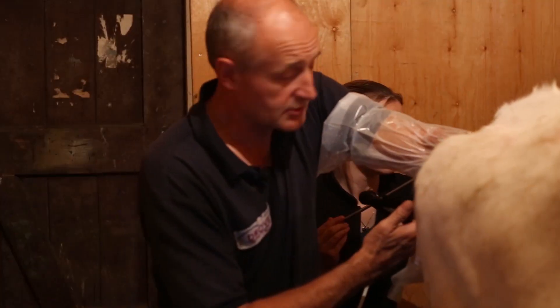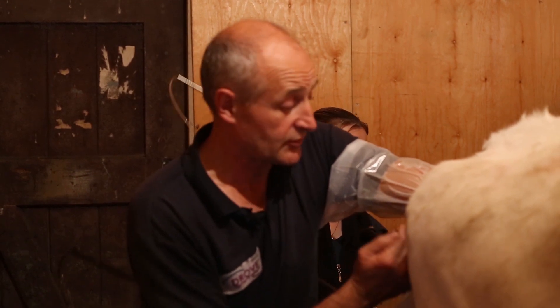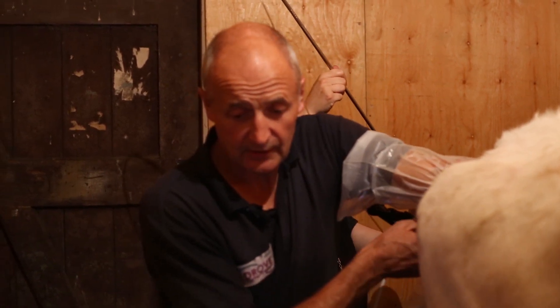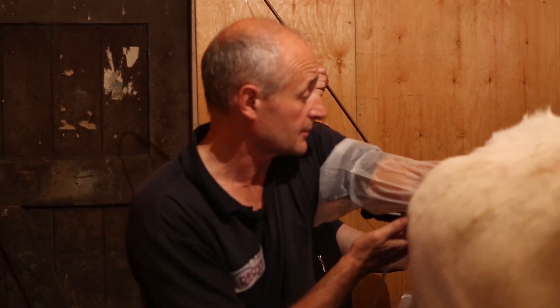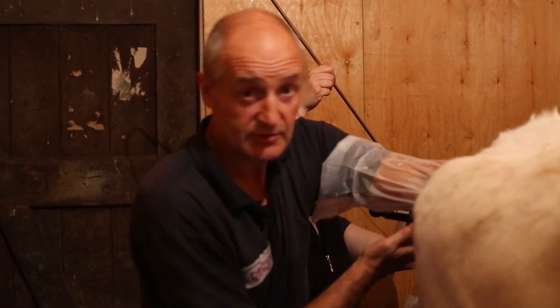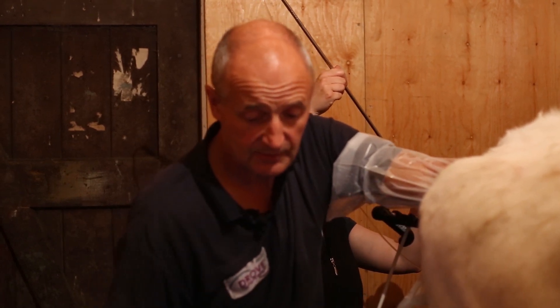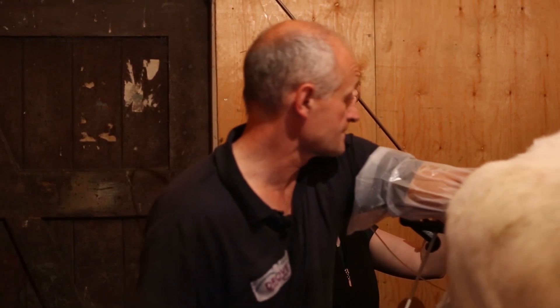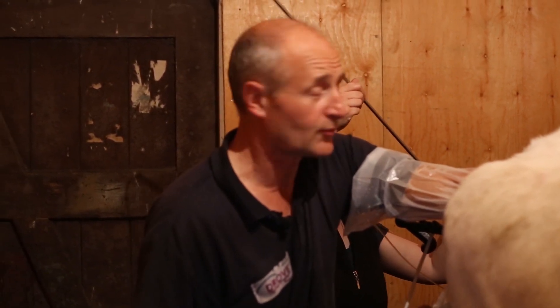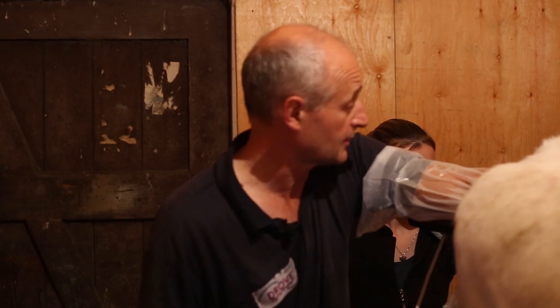The equipment I'm using today has been made for our project by BCF. This is the third set of equipment I've been using and it's the best so far. The handle is really better for my assistant to work with me, and the picture on the screen is the best I've had. Hopefully that means we're getting more follicles punctured, more oocytes collected, and ultimately more embryos produced and more pregnancies thereafter.